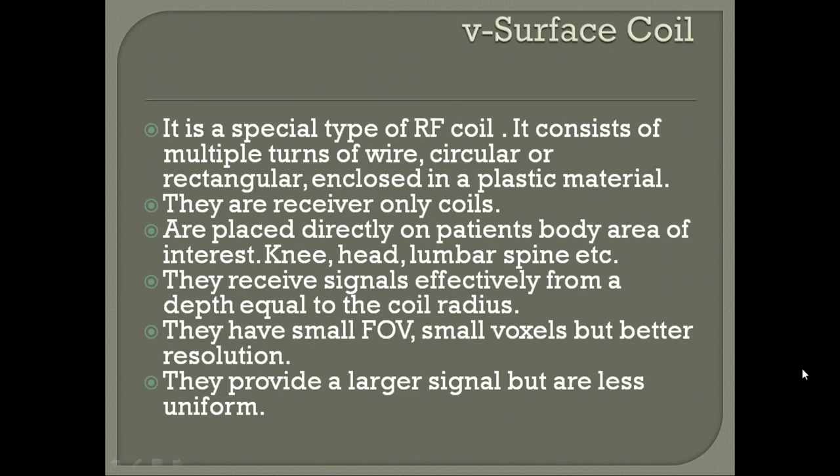Now we come to the surface coils. Surface coils are basically a special type of radio frequency coil. It consists of multiple turns of wire, circular or rectangular, enclosed in a plastic material. Surface coils are receiver coils only.